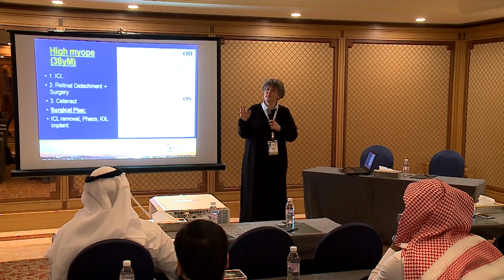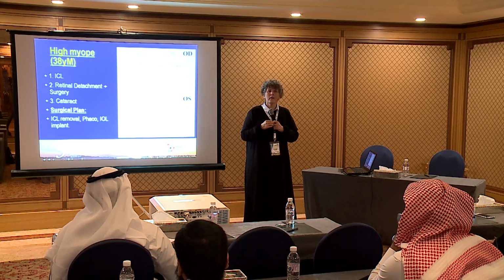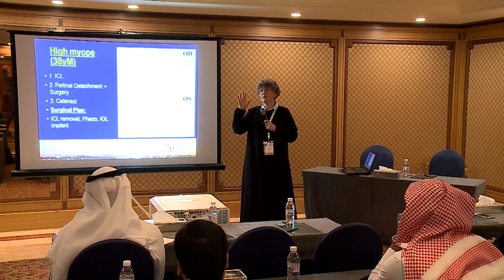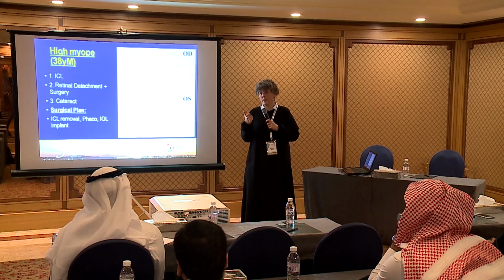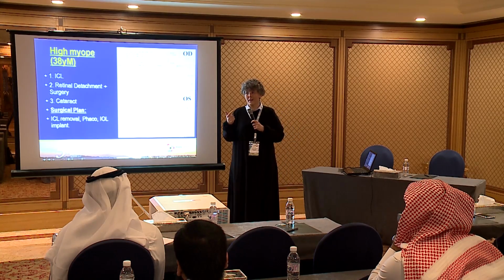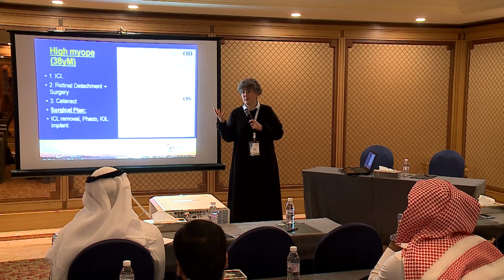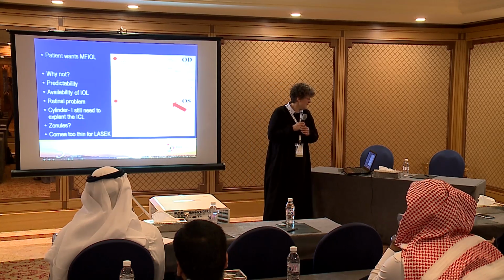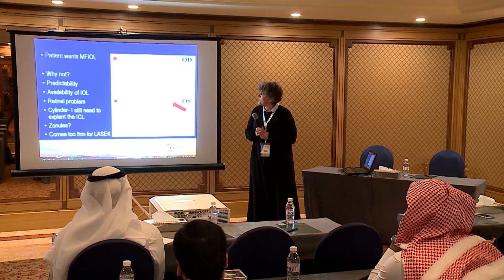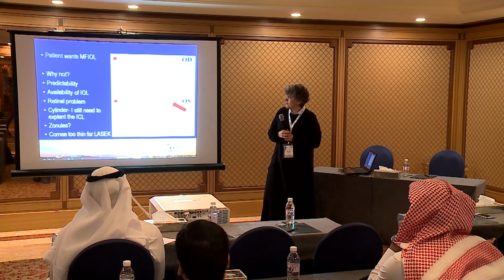So I told him, you know what? I'm not going to do a multifocal IOL on you. I'm going for a plain monofocal IOL. If you'll be happy, it's okay. If not, we can always put in an add-on. I think you must be a little bit crazy to get surgery for your ICL, then get a vitrectomy, then get your ICL explanted, then get your cataract surgery done, and then do an elective add-on multifocal IOL. I didn't tell the patient that that's what I thought, but he didn't go for the last one. So I was quite happy with him. I guess I convinced him. Okay? So the predictability was a problem, and the retina was a problem. It's the same patient. In the end, we did it.